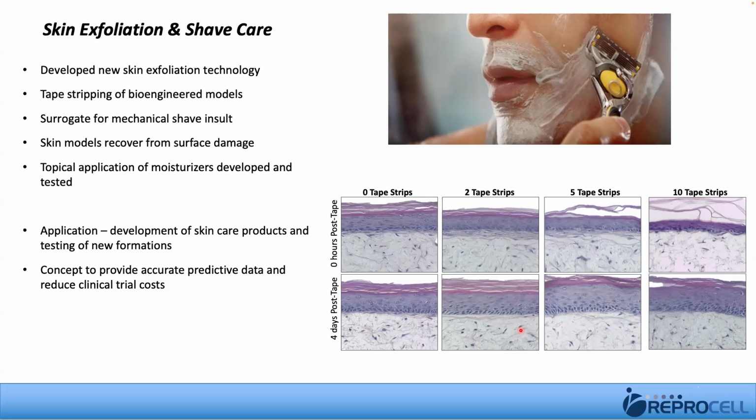What's nice about this is that if you then put those models back, you see them then come back and grow and recover.